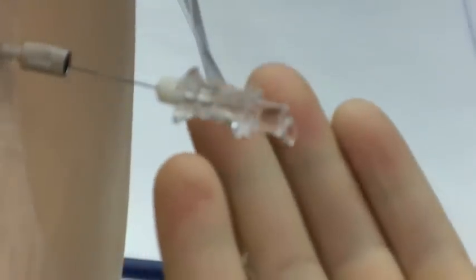So we're confirming our CSF flow. As you can see, the drop of fluid. I'm going to hold the needle at the hub. Make sure there's a secure connection between my syringe with bupivacaine and morphine. I'm going to withdraw, and you see a positive swirl of CSF.